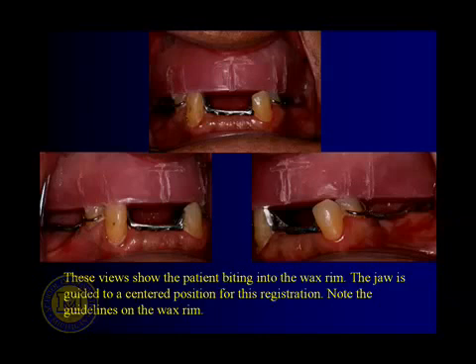Okay? What I will usually do is just have them go through that motion: moisten lips, open and bring their lips together. And then if I just take the heel of my hand and set it on their sternum and take my thumb and just have my thumb ever so lightly touch against the inferior edge of their chin when they're at physiologic rest. And then I just say, would you close?